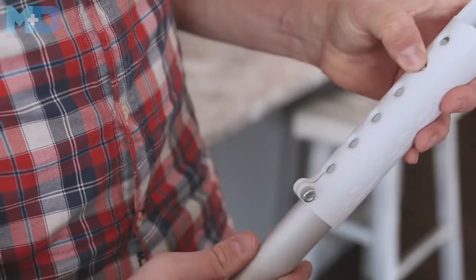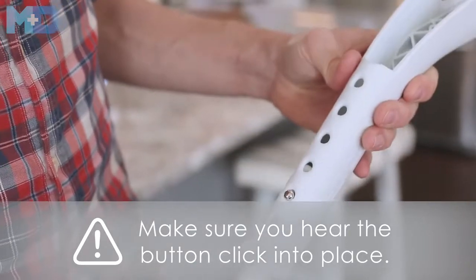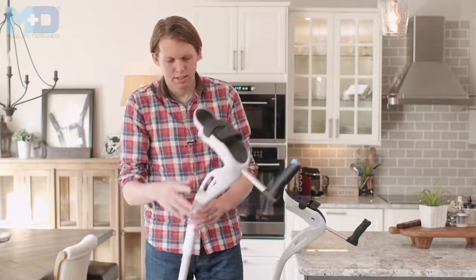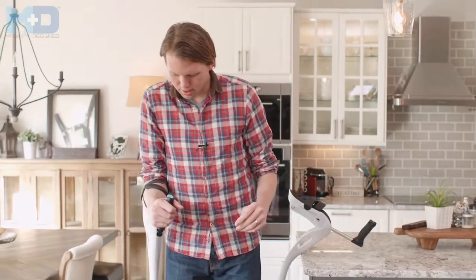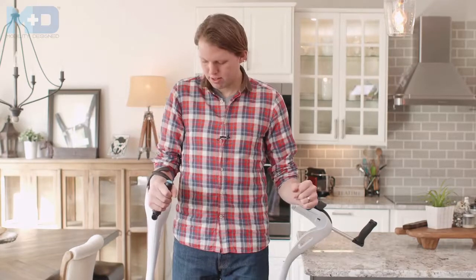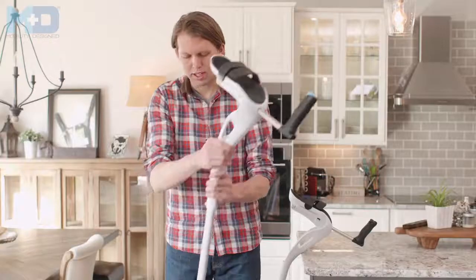On the back, you push the button and click until you think that might fit you. Let's see if that fits me. Which you can see right now, I'm still a little bit too short. So we'll raise it up another notch.